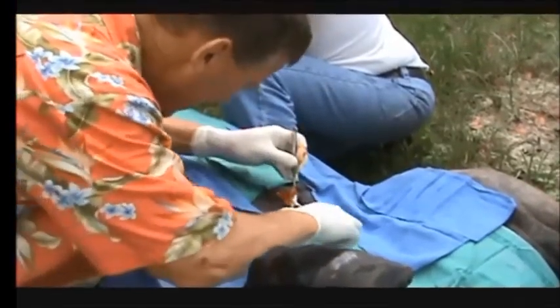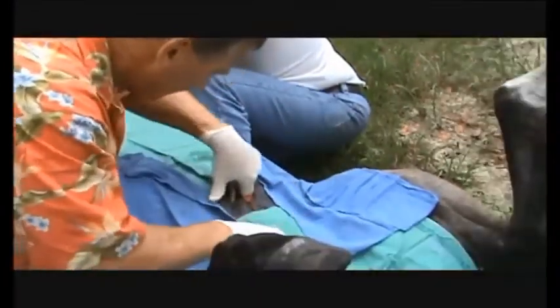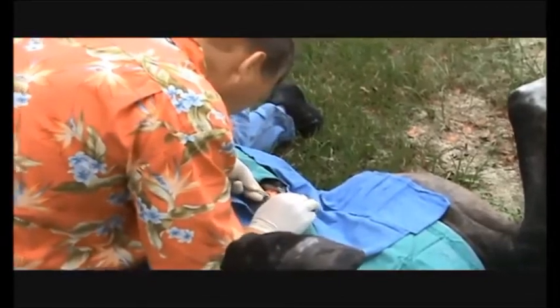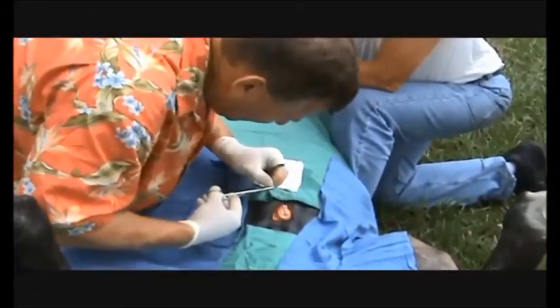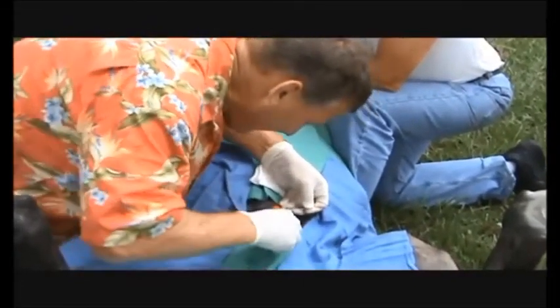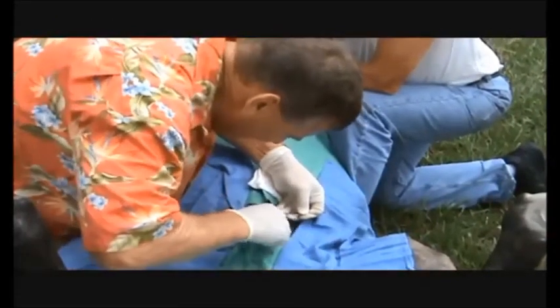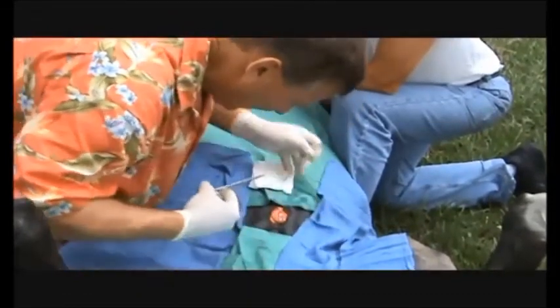The biggest thing I find with closed umbilical hernia repairs is you're trying to close intact tissue to intact tissue, and I always worry it won't heal that way. So he's going to show you how he closes this by putting the dull end of the scalpel blade under the hernia ring to protect the intestines. So this is a tying platform sort of thing. He slides the opposite end underneath the body wall, and then he can stick his needle on top of the scalpel handle without stabbing any guts.